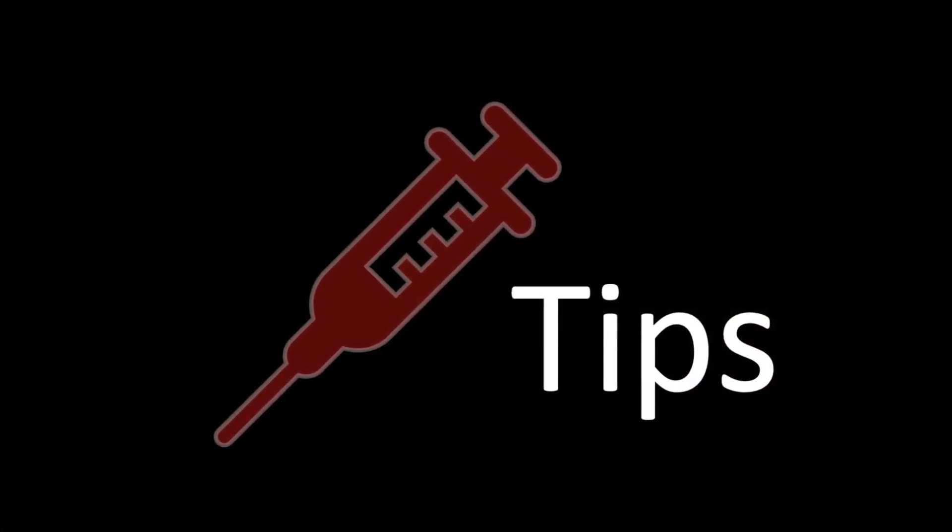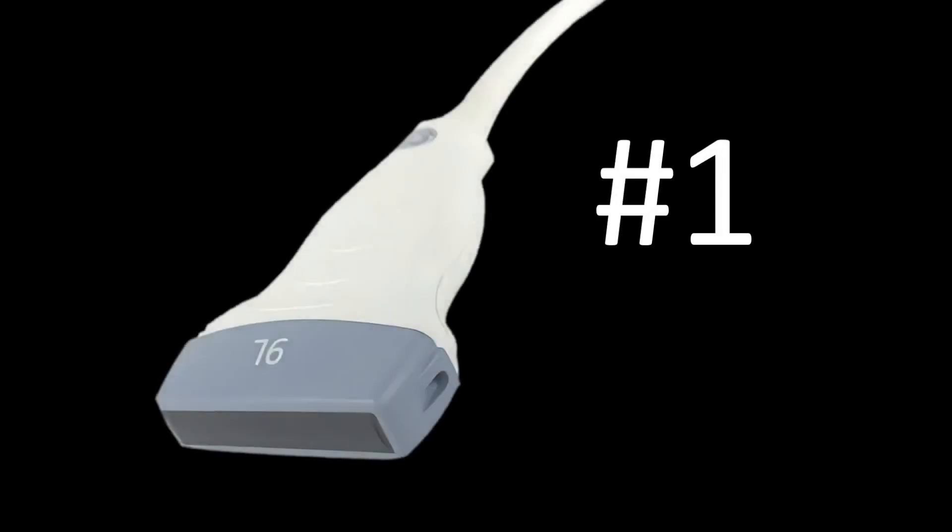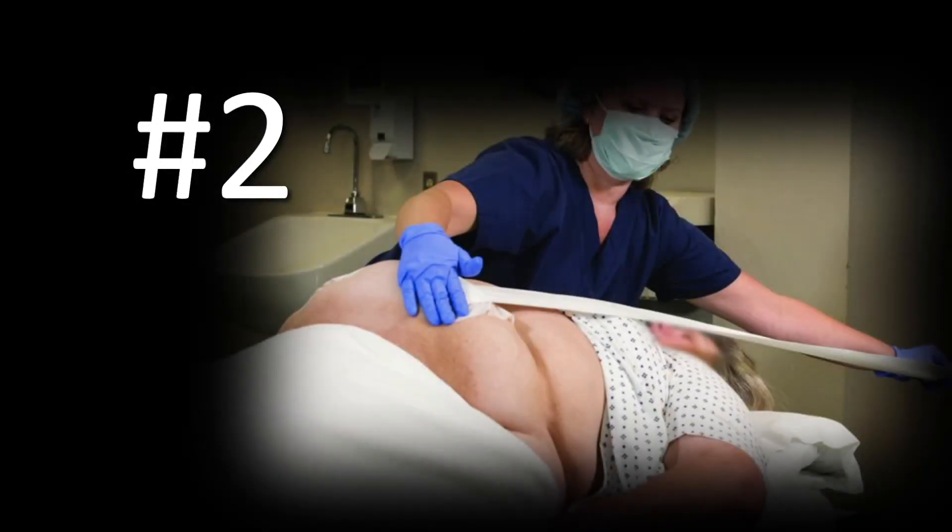So let's finish up with some tips for if you do indeed decide to place a femline. Tip number one, if you have the ultrasound sitting next to you, just grab it. Even if you're in a code situation and you decided that you're putting in a quote-unquote crash fem, if you have the probe nearby, just pop it on the patient and it can help guide you in the direction that you need to go to get access. Tip number two, if your patient is obese, position them in a way that you can get any extra tissue out of the way, like maybe putting them in Trendelenburg position if they can take that, or just taping tissue off to the side and that's going to clear up your workspace.